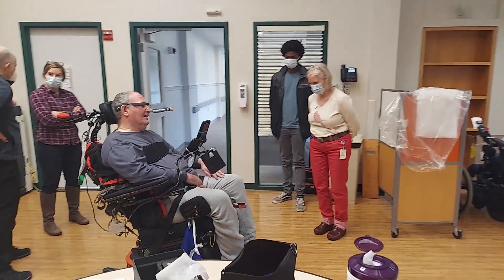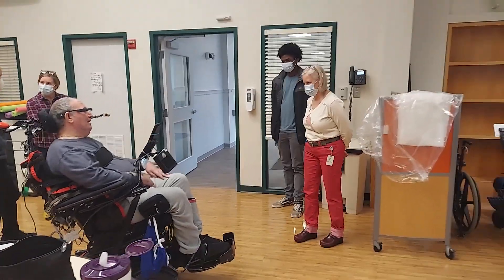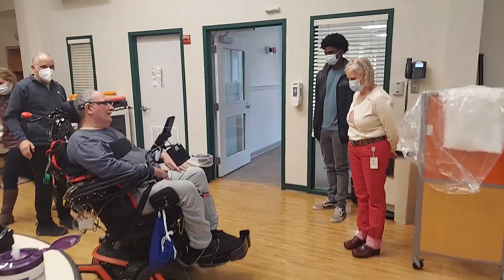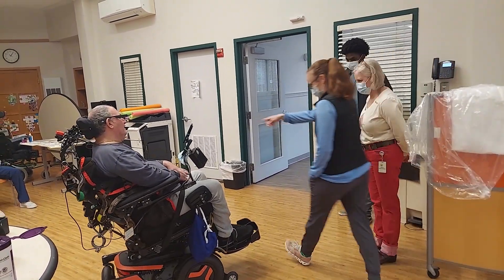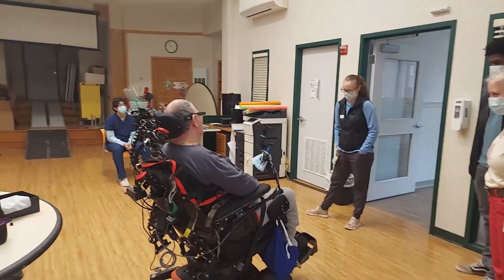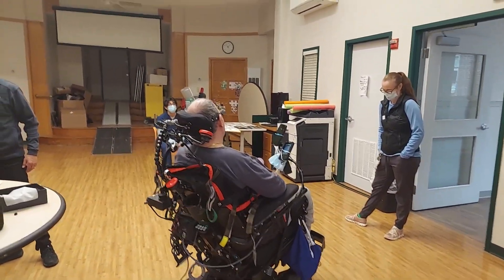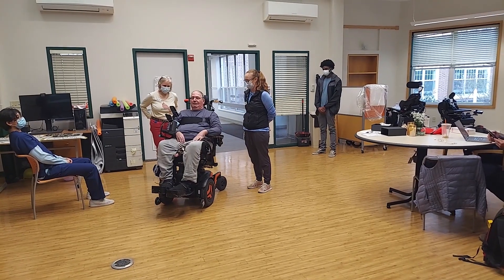Just keep trying. Now I want to take it off my phone. Try to just make a loop around here — we moved some stuff for you. Head back to drive forward.